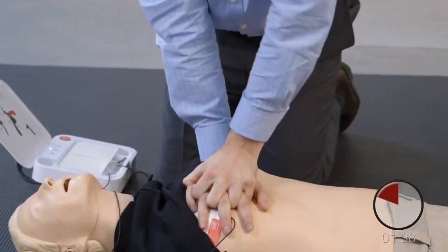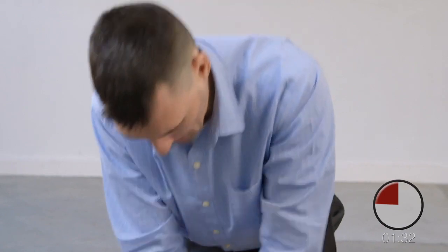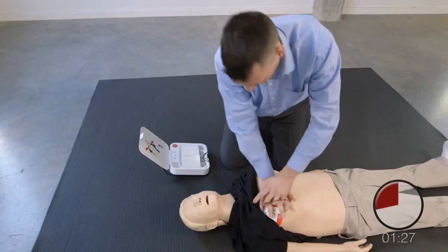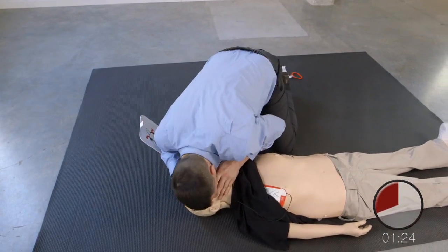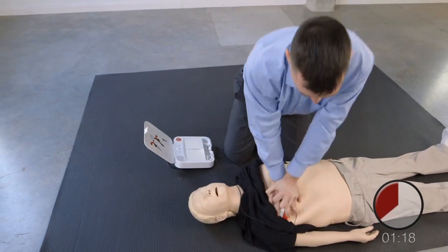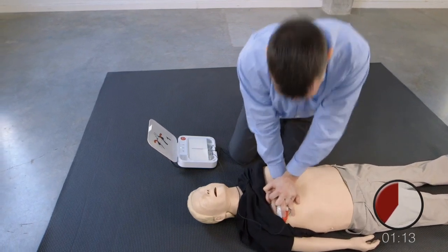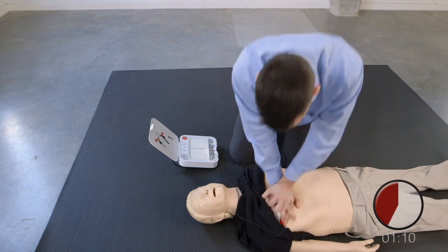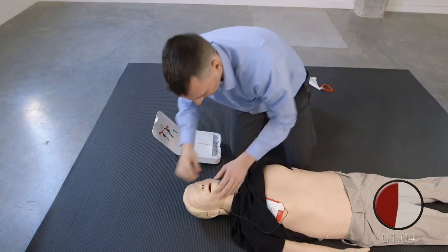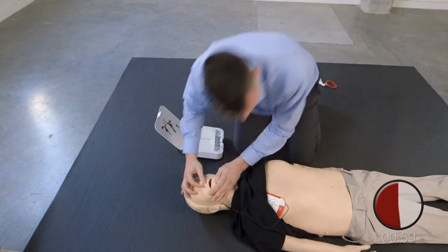Tryck ner hårt minst fem centimeter. Gör två inblåsningar. En. Två. Återuppta bröstkompressionerna. Tryck ner hårt minst fem centimeter. Gör två inblåsningar. En. Två. Återuppta bröstkompressionerna.